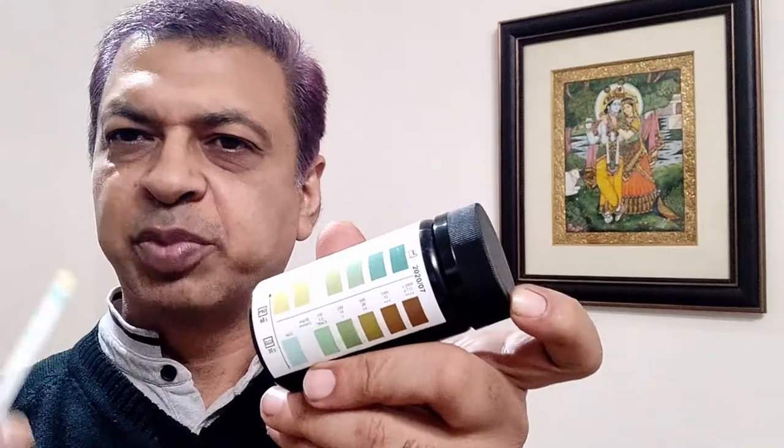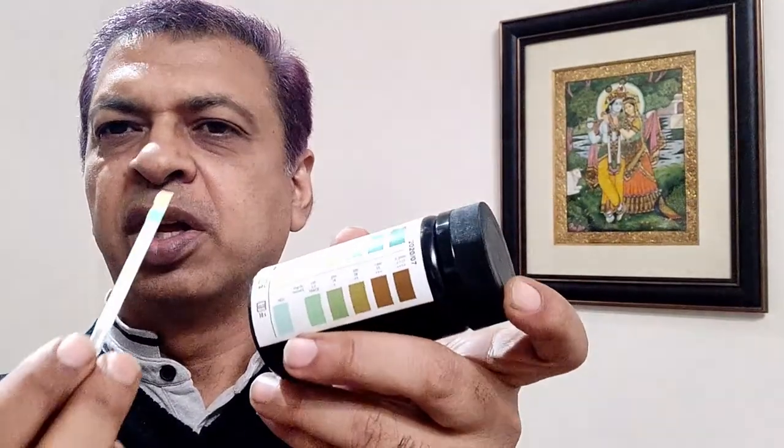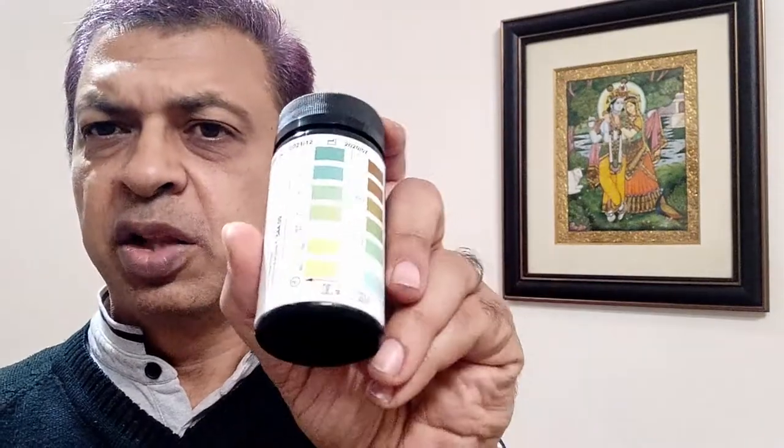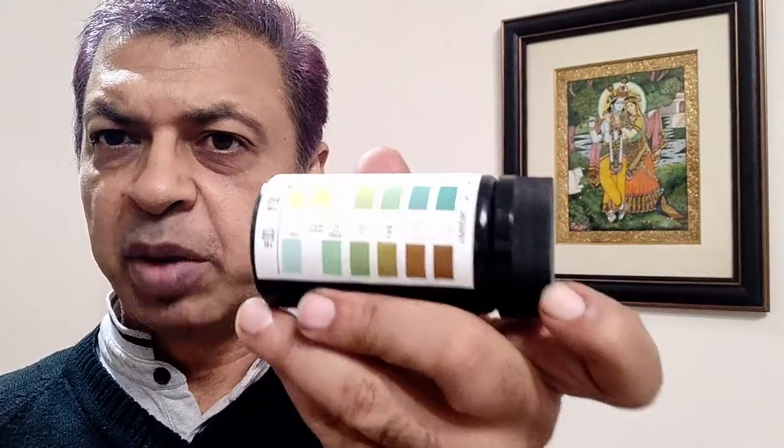You can also do the test in a lab, because most labs use the same strips on your urine to check these parameters. Of course, there are different types of strips available: single-parameter strips for only glucose or only protein, strips for ketones, and strips for albumin-creatinine ratio, among many others. The one I have here is only a two-parameter strip, so pick the right strip depending on your condition and do the test at home to monitor your urine parameters economically.